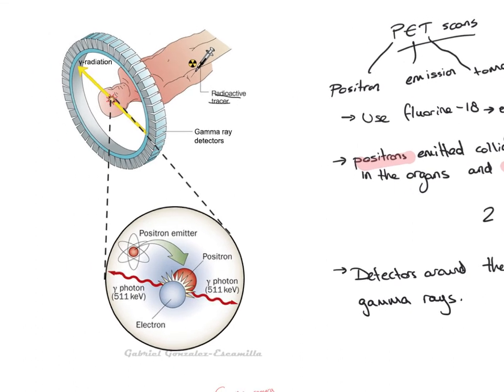As you can notice, around the head of the person, instead of having X-ray sources and X-ray detectors, you only have gamma ray detectors. So there's a whole array of gamma camera detectors there. Basically, the scintillator and collimator are all lined up around it and picking it up.